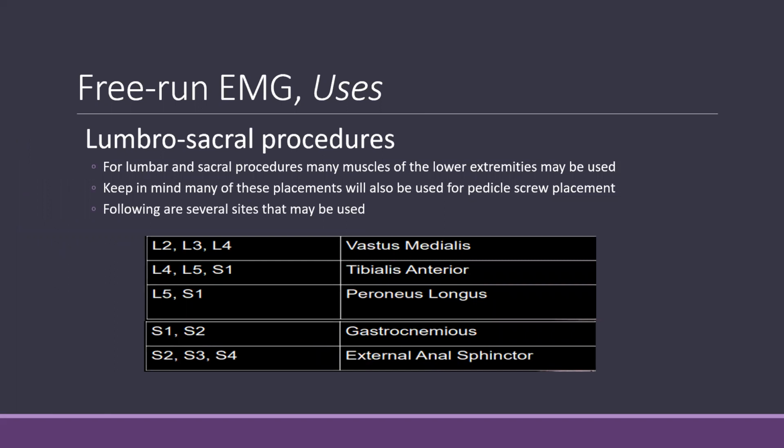For lumbosacral procedures, there's a lot of muscles that we have the option of monitoring here. So keep in mind, many of these placements will also be used for pedicle screw placement and testing, so they can pull double duty. Following are several sites that may be used.